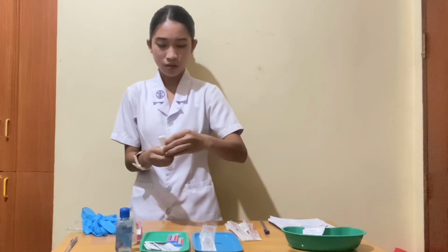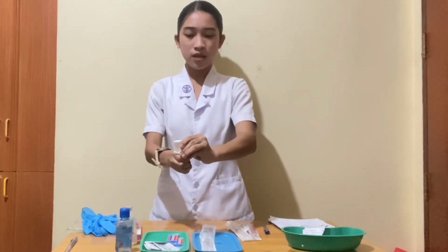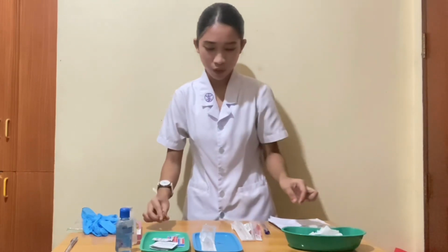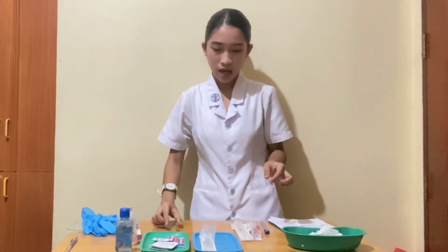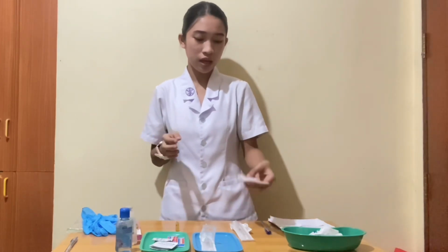Now I'm going to break it. Now I'm going to dispose of this one. As you can see, I've already opened the ampule, and next I'm going to get a 3cc syringe and open this one.